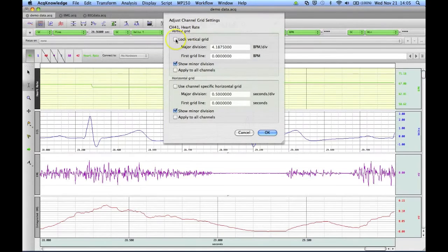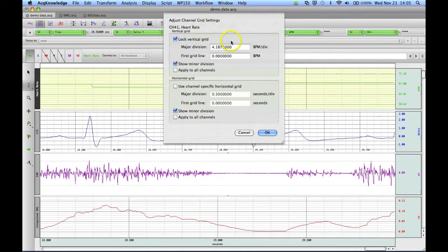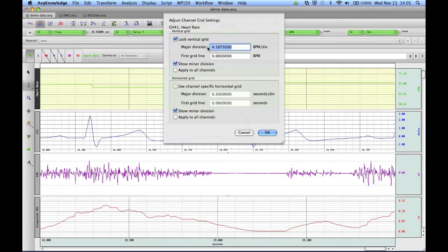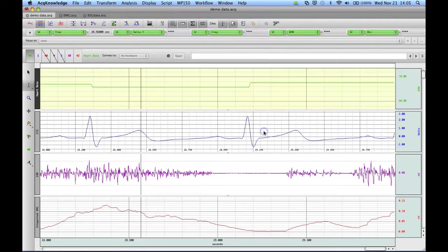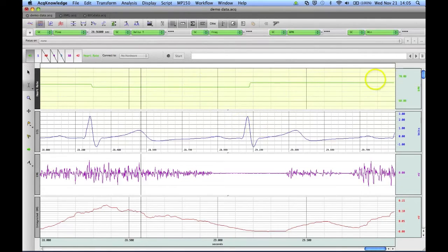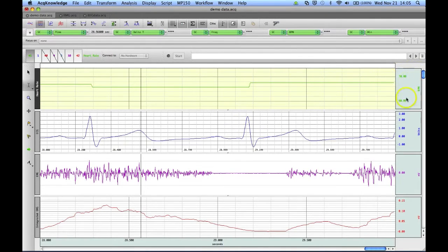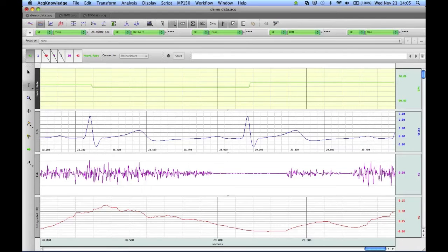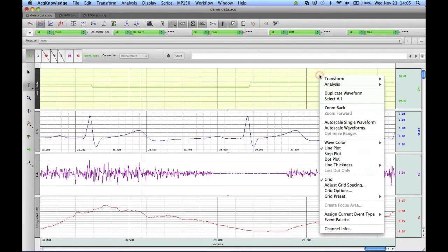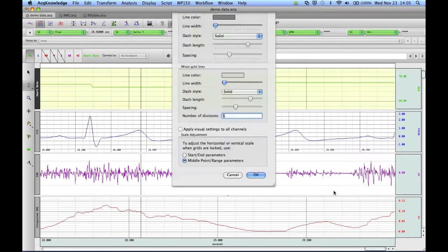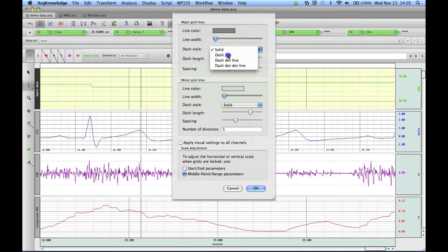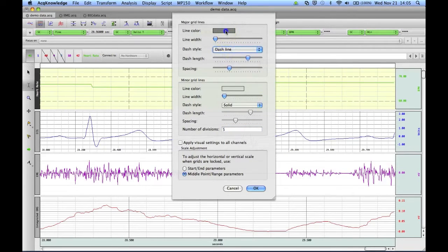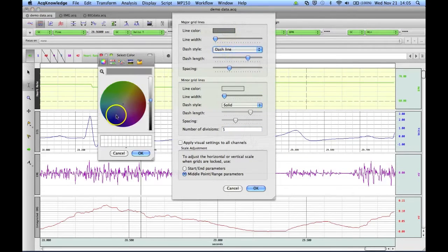Lock that vertical grid, add a 10 second beats per minute per division, and click OK. And you'll see now, we've got those lines again for the major divisions at 60 and 70, but they're the default colors. And we could again go in through Grid Options to change those to something else.